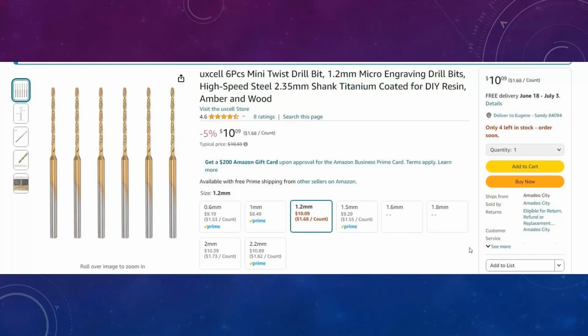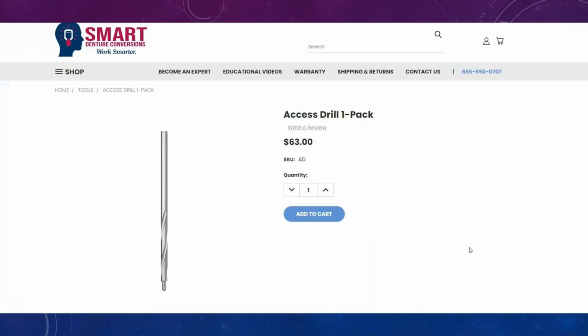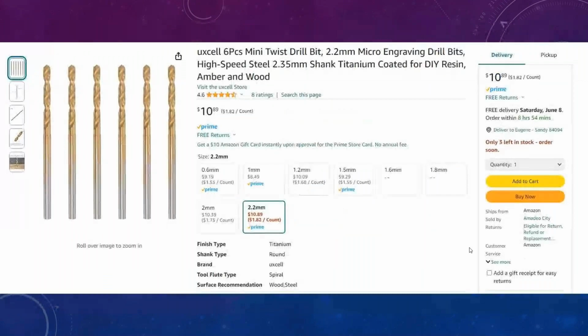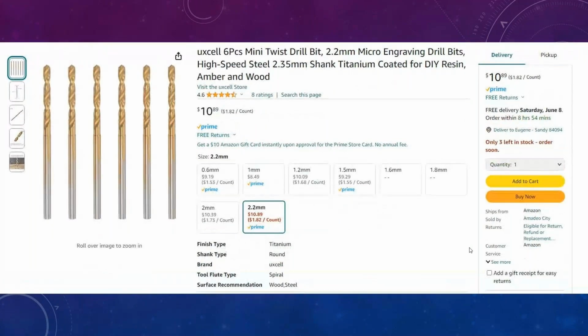This one I use from the implant side, and then I reuse this one to clean things up from the tissue side towards the implant. And this is what I use to clean things up from the tooth side all the way to the bottom. Hope it makes sense. Oh, another thing, guys, I really like to use these drill bits.